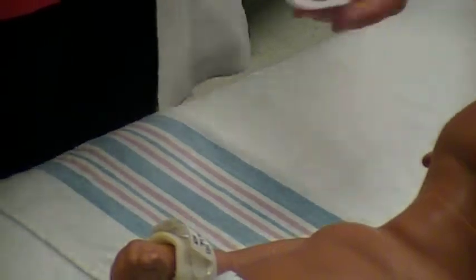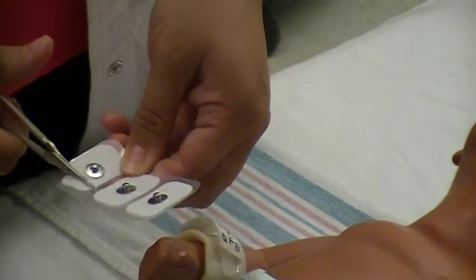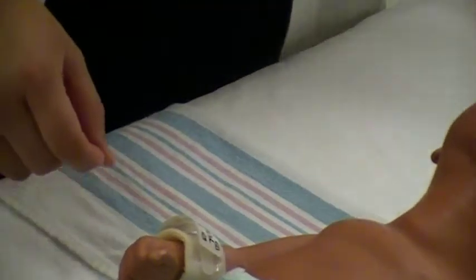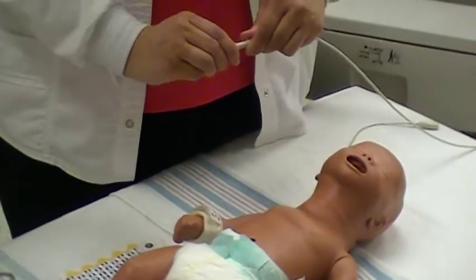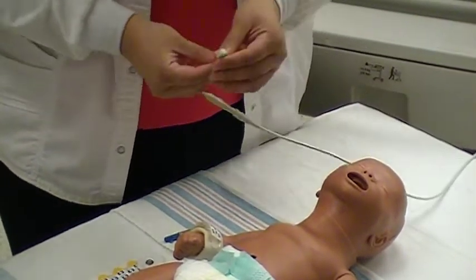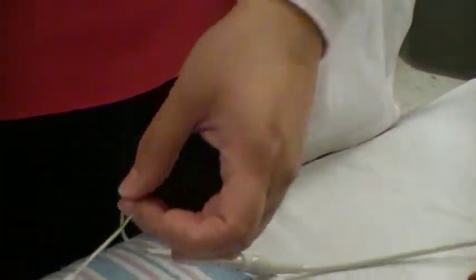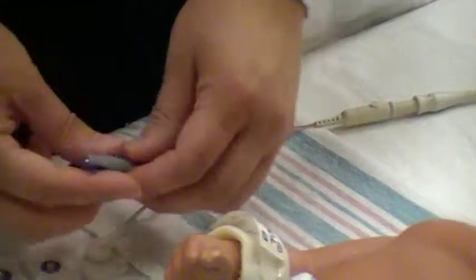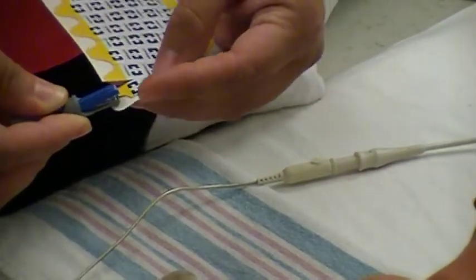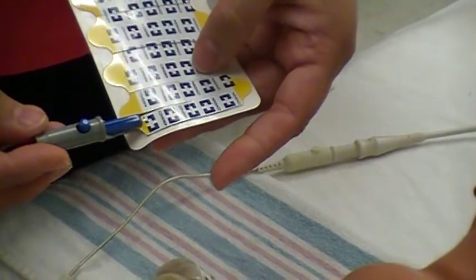If using snap electrodes, these can also be cut to size. Snap electrodes are connected to the EKG machine by removing the alligator clip and inserting a clip-adaptive EKG lead. If using the alligator clips when positioned on the chest, the blue side is facing up when connected to the chest lead.